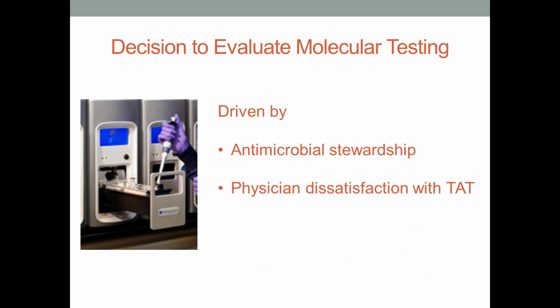So our decision to evaluate molecular testing in our hospital was really driven by two things. One is that obvious dissatisfaction from our physicians with turnaround time, and the other was really antibiotic stewardship. Initially this was in the area of positive blood cultures. There was a motivation to decrease long-term use of broad-spectrum antimicrobials and to be able to get actionable information 1 to 2 days earlier that allowed physicians to narrow treatment.